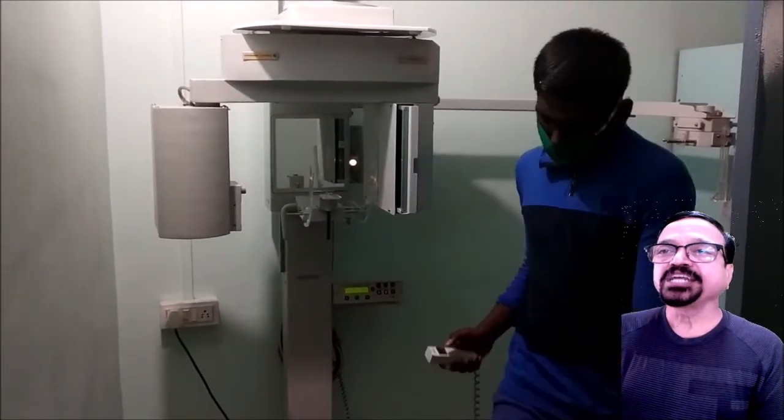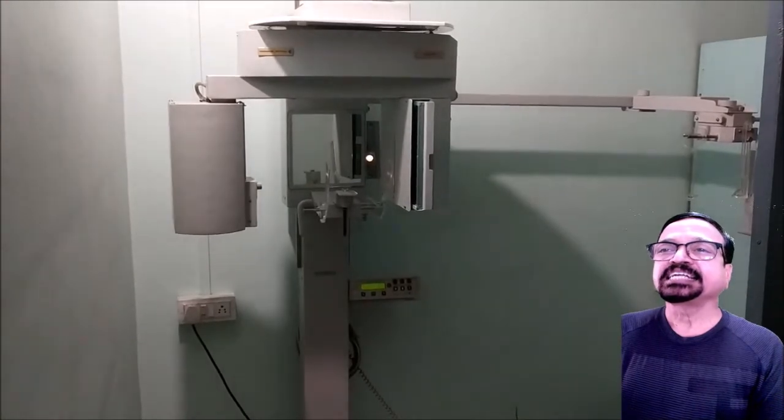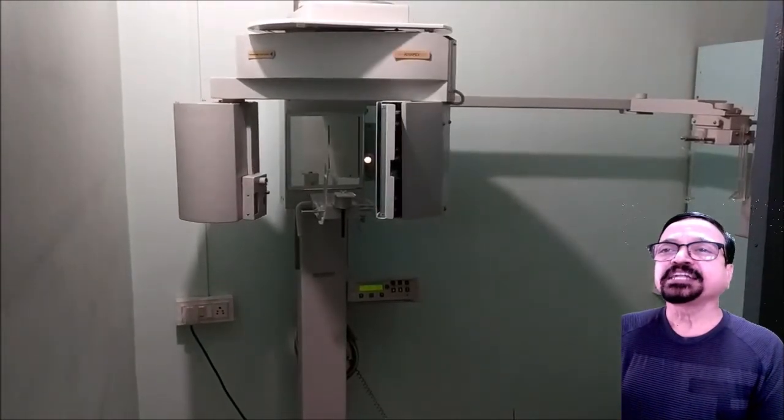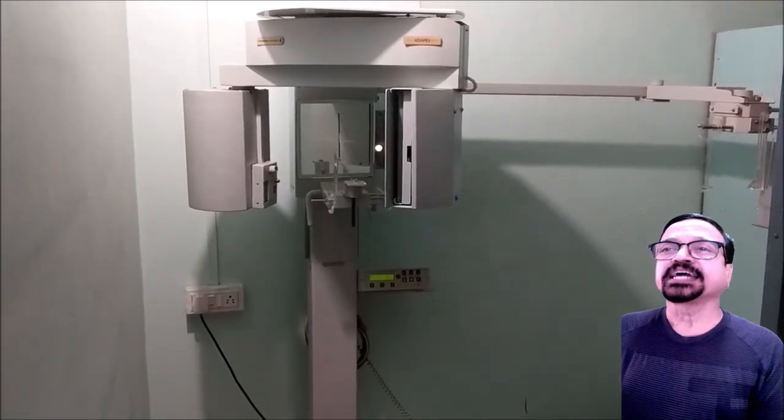Now this is a digital machine, so now see it will get reset. Now once we press the button, because it has to make a rotation of 360 degrees, so it is over the correction.